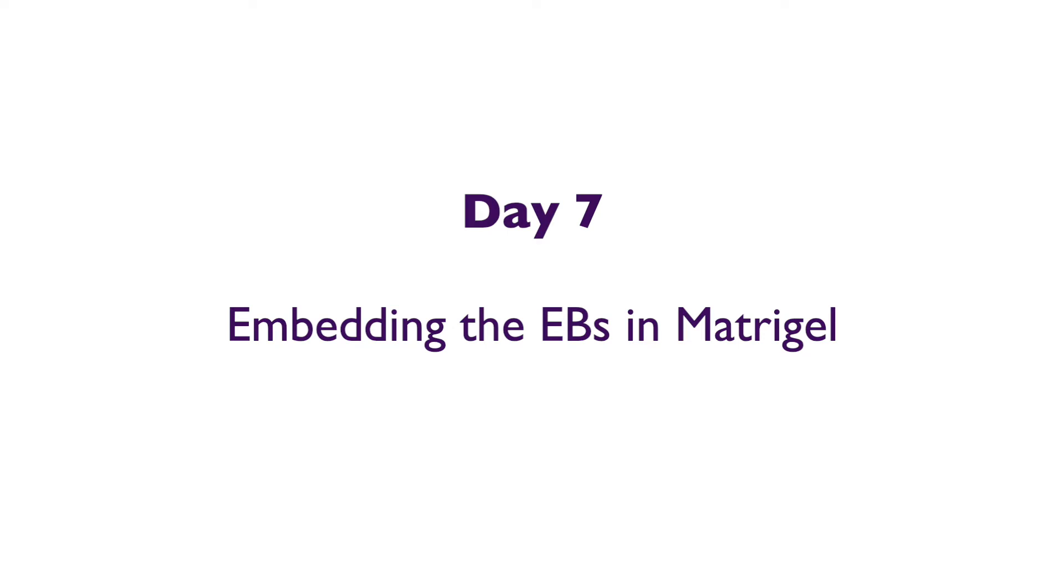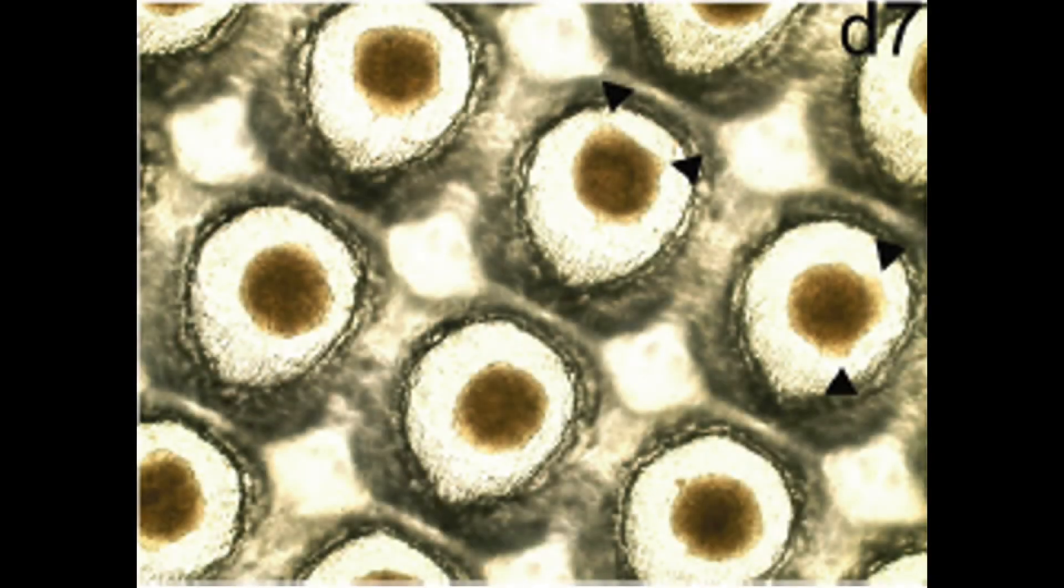When looking at the EBs under the microscope on day 7, you will most likely notice the appearance of neuroectodermal buds, as indicated by the black arrowheads. These buds become more pronounced after 24 hours in Matrigel embedding.